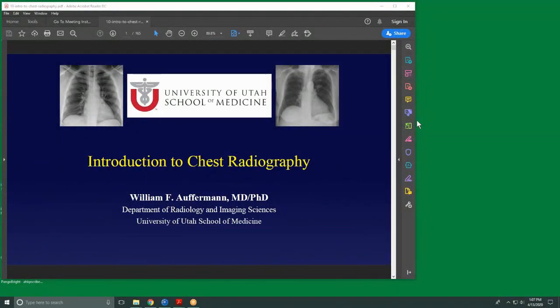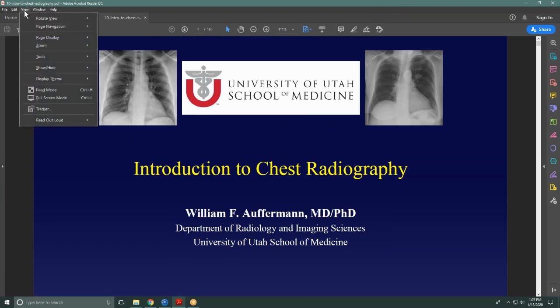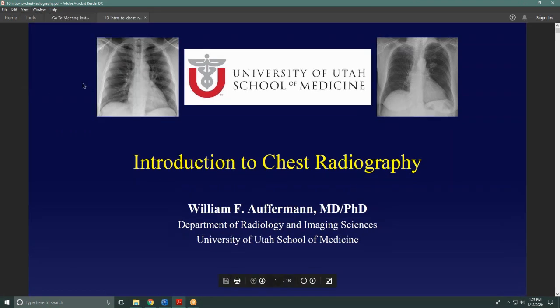I'm Bill Aufferman. I'm going to be talking today about an introduction to chest radiography, kind of picking it up from where Dr. Mann left off a little bit earlier. And like I said, we will be having quizzes at the very end of the 2 hours. And please feel free to ask questions as we go along.